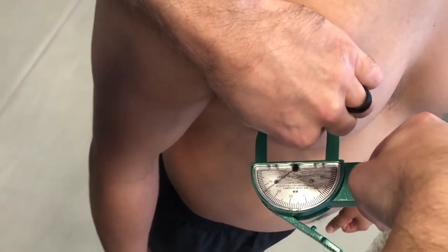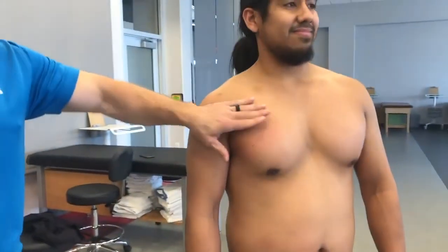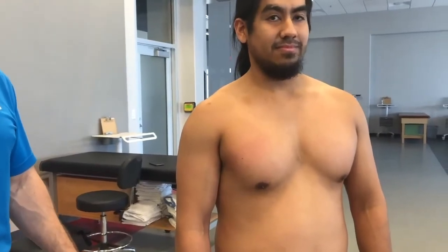We're then going to record our measurement as 13 millimeters. We'll push the button down so that we don't pinch them even more, and we're going to relax and come back to that after our six other sites.